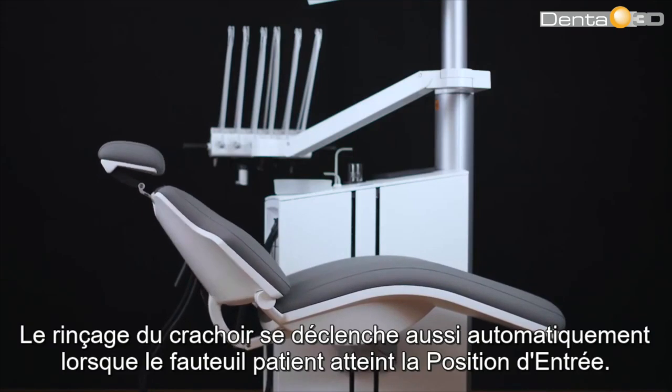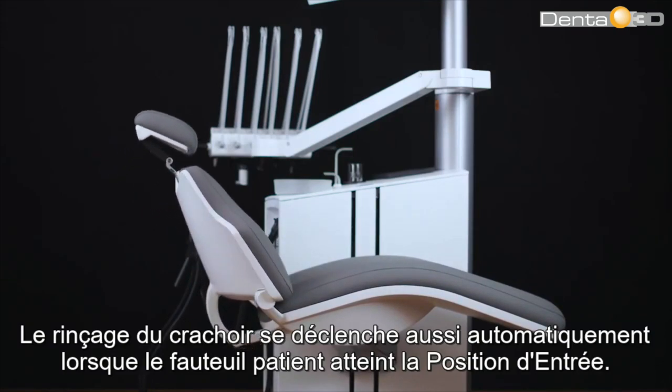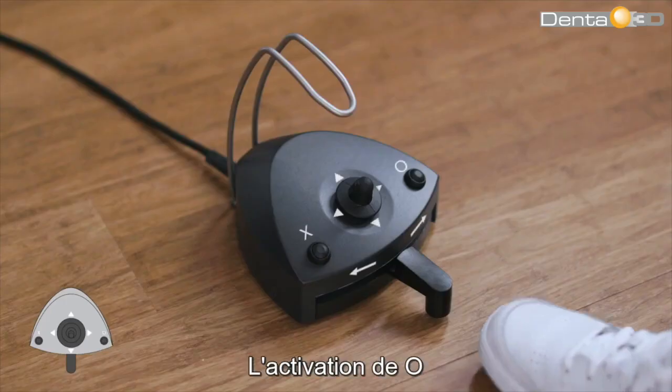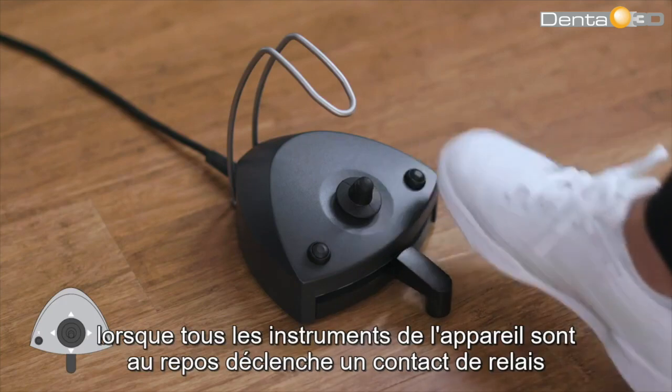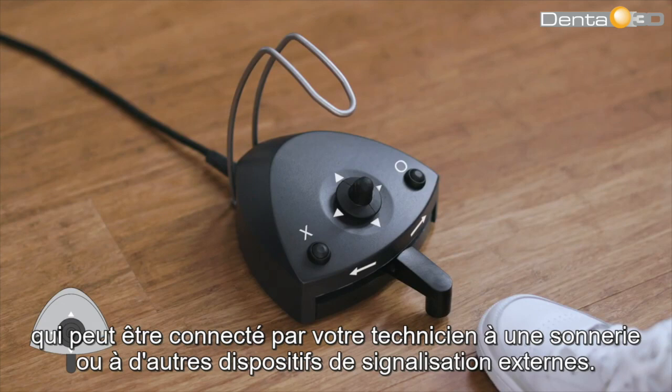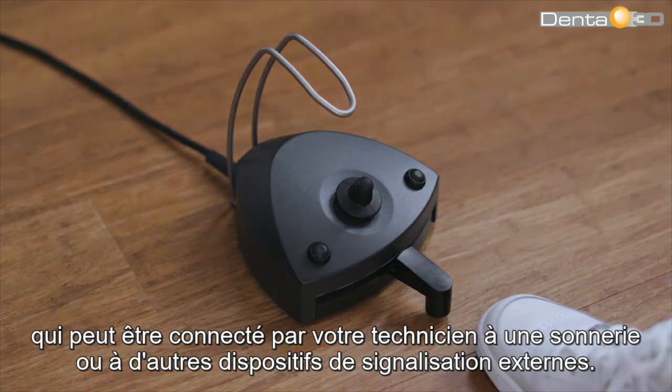The cuspitor flush will also start automatically when the patient chair reaches the entry position. Activating the O button while all unit instruments are at rest will activate a relay contact that may be connected by your technician to a bell or other external signaling device.